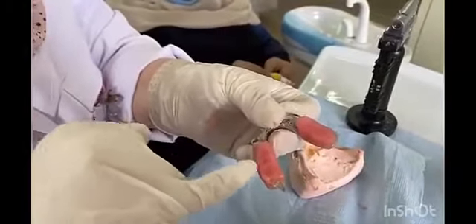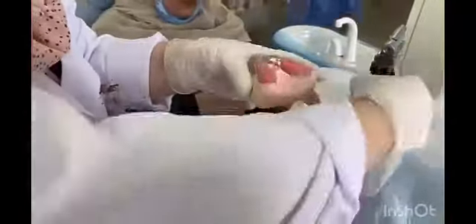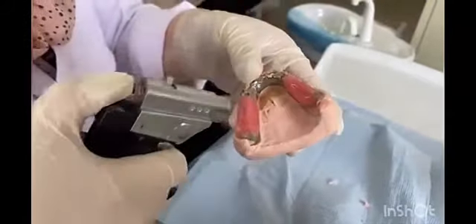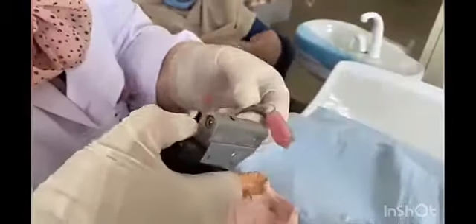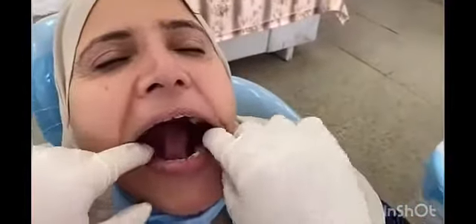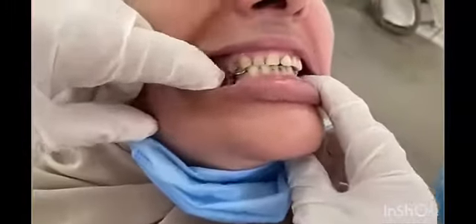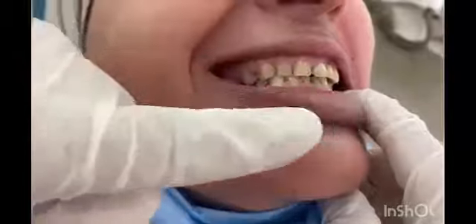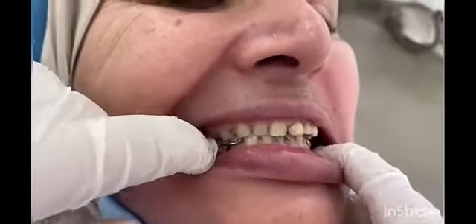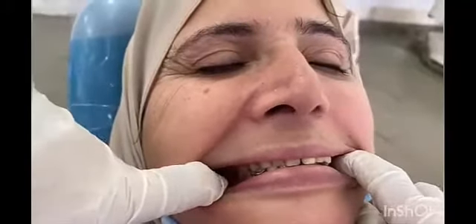بعد ما أخرجته من بق الpatient، الupper molars عاملين imprint في الlower wax من الصايد ده. بس الصايد التاني لأ، فممكن يكون الwax برد مني. هعمل له re-softening وهحطه تاني في بق الpatient وأخليه يقفل برضو في السنتريك. كده أتأكدت إن الocclusion بتاع الpatient مظبوط والvertical stopper في مكانها في الtwo sides، والupper molars عاملين imprint في الwax في الtwo sides.